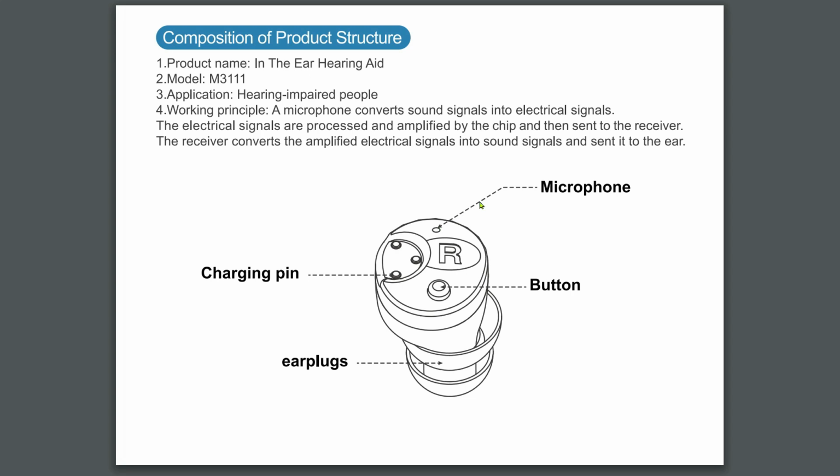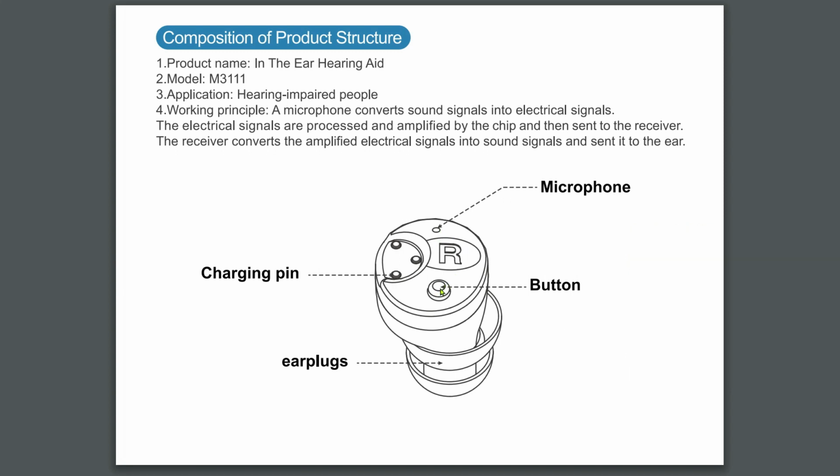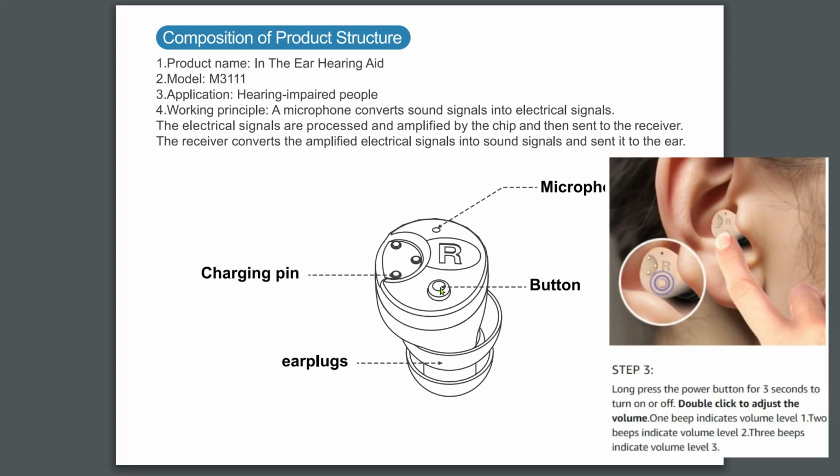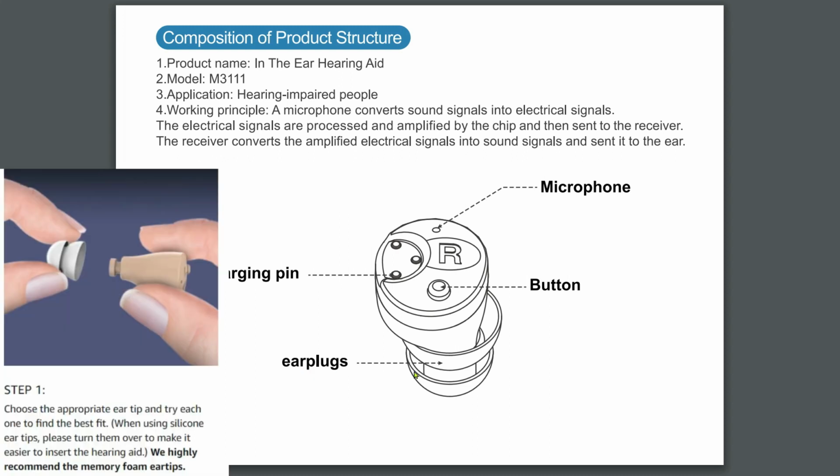And there is the microphone on top, and this is what they want you to orientate when you put this in your ear. And there's the control button that does the power on, power off, and also the volume control. That is all you have that you can control on this headset. It's very simple, and it has software in there that really takes care of all of the other aspects. Here is the earplug that I demonstrated putting the foam one on.